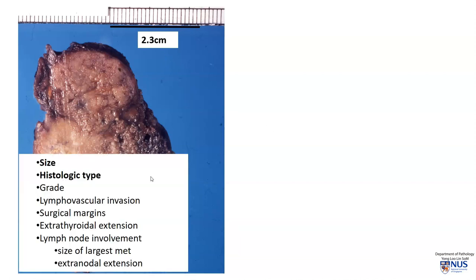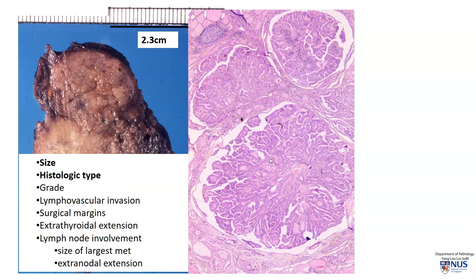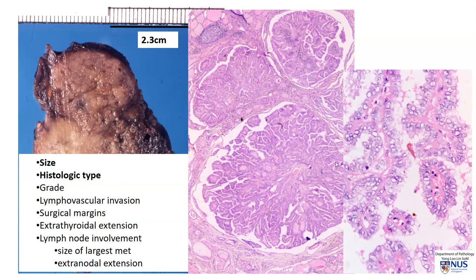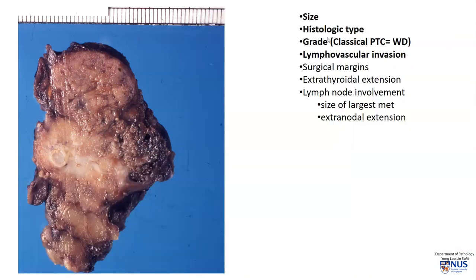The next thing we want to look at is histologic type, and we can clearly see that this is a classical papillary thyroid carcinoma with very well-formed papillary structures and the very classical nuclear features. So tumor type is classical PTC. We don't actually need to grade this separately because classical PTC is, by definition, well-differentiated thyroid carcinoma.